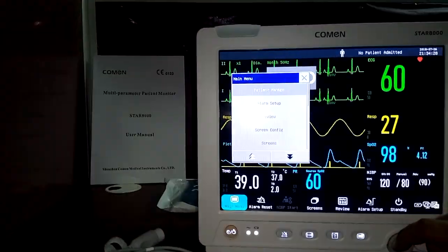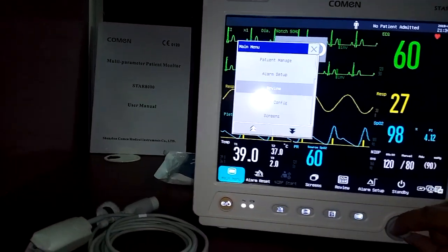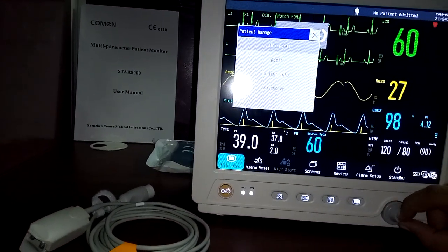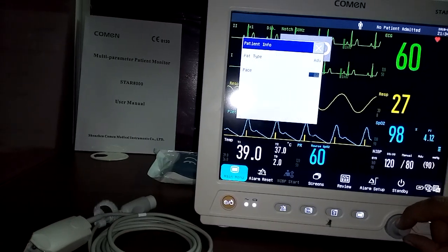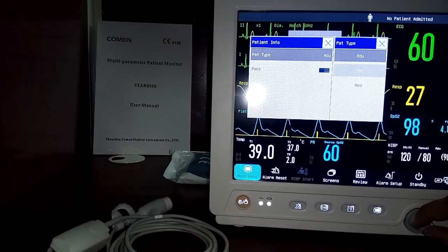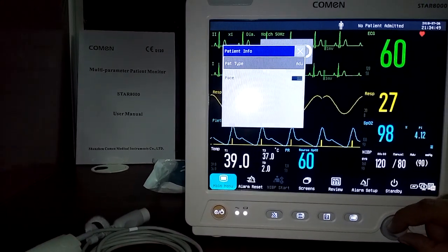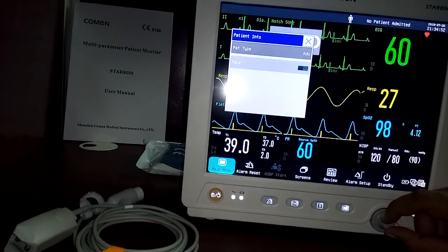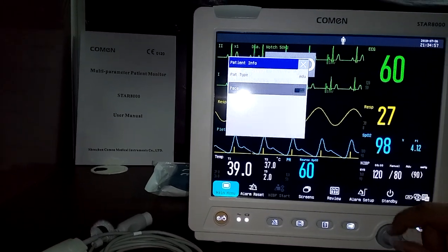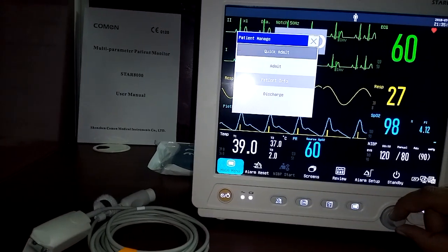Under the manage patient menu, you can admit a patient, view or delete previous records, and select patient type — adult, pediatric, or neonatal. Pacemaker detection can be switched on or off. You can also admit or discharge a patient from this section.